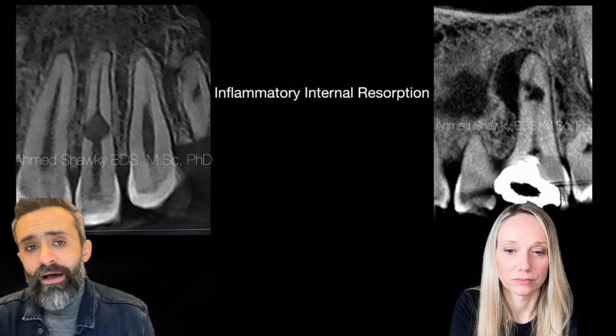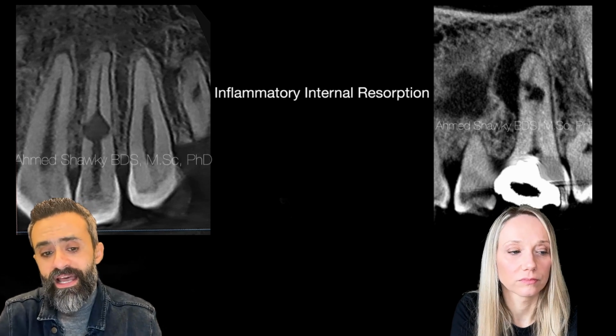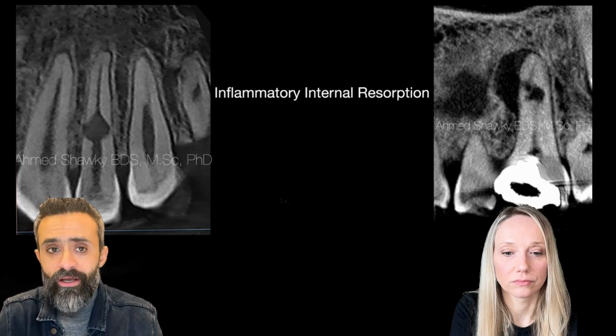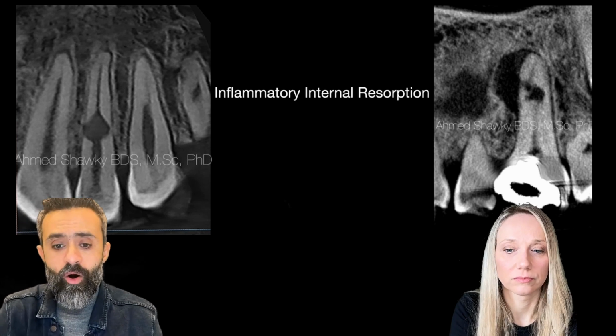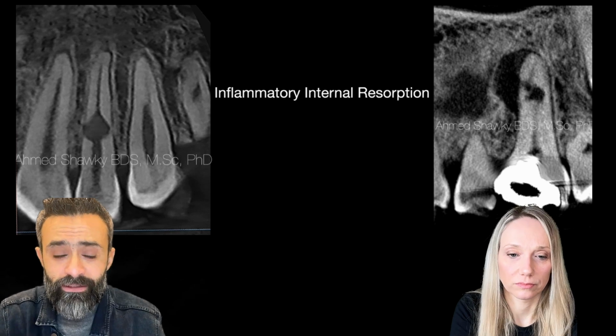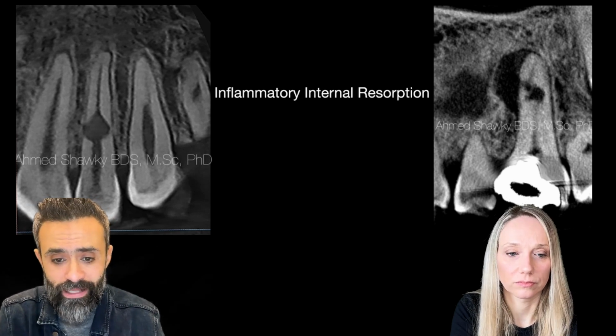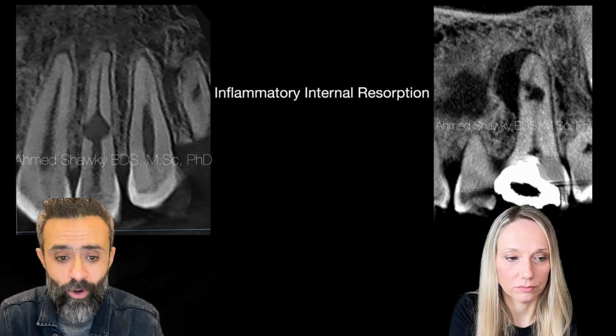And apart from the vertical root fractures, CBCT can also help us to determine the size of the inflammatory internal resorptive defects, whether perforating or non-perforating, which will reflect on our treatment decision and treatment plan, whether it be a surgical, non-surgical, or combined approach.